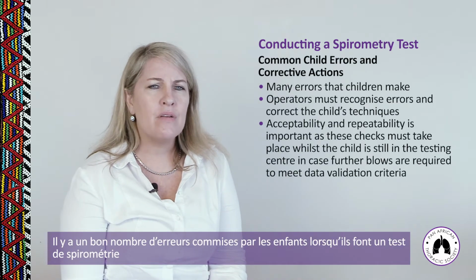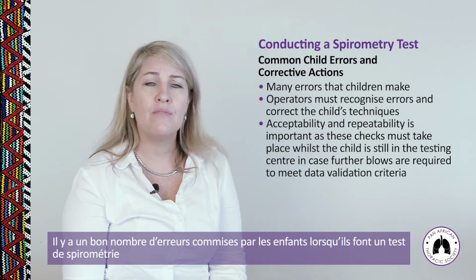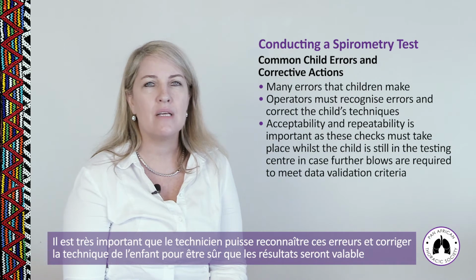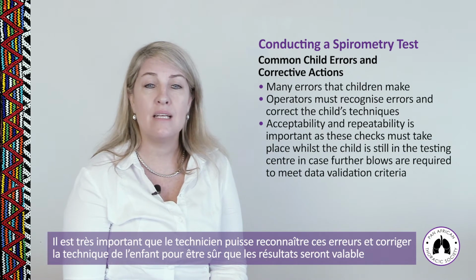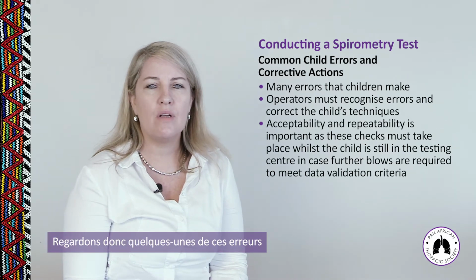So there are many errors that children make on a regular basis when conducting spirometry tests. It's very important that the technicians are able to recognize these errors and correct the child's technique to ensure that the data is valid. So let's have a look at some of these.